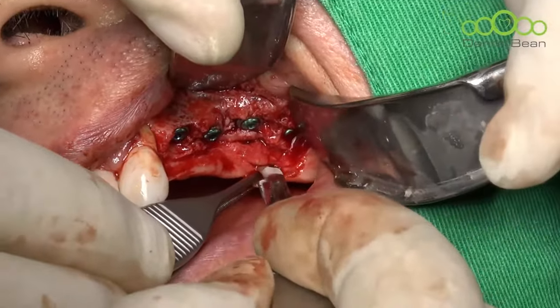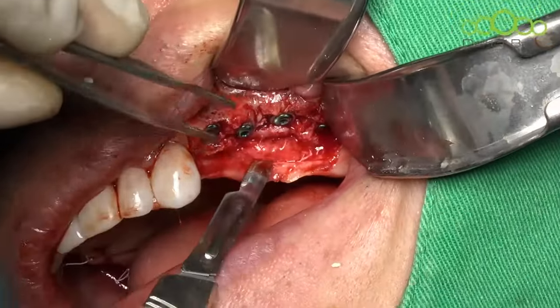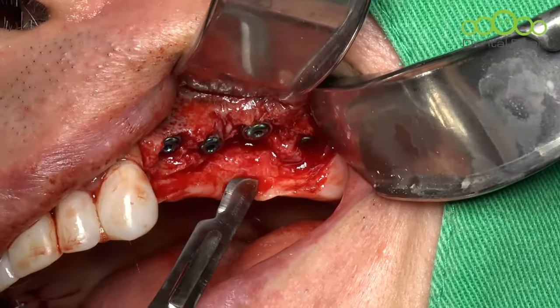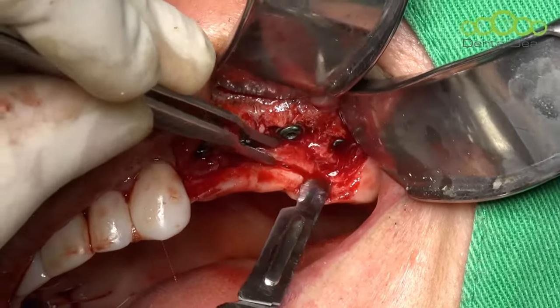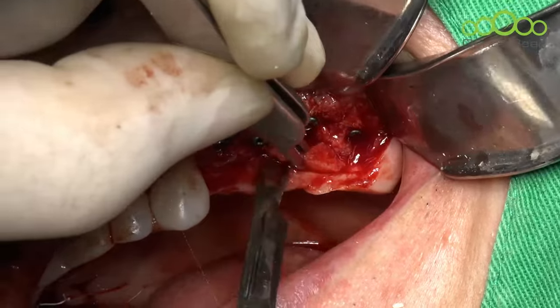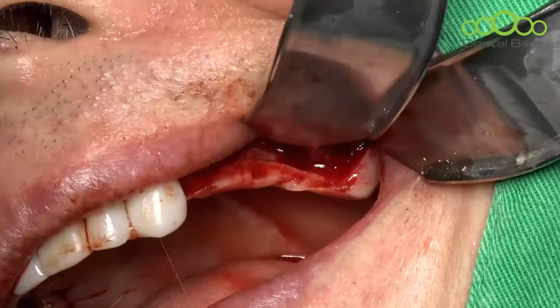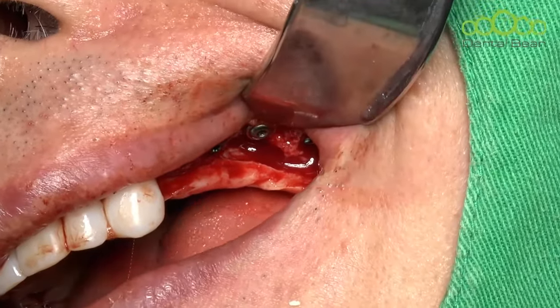I need to change the blade. 15 blade. Okay. Keep this one. Because of too thick soft tissue, I need reduction.